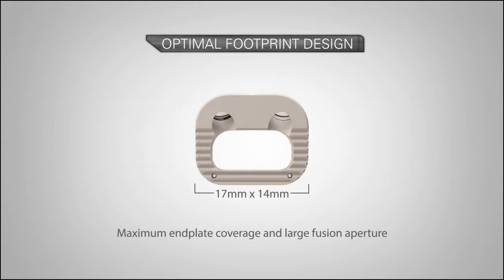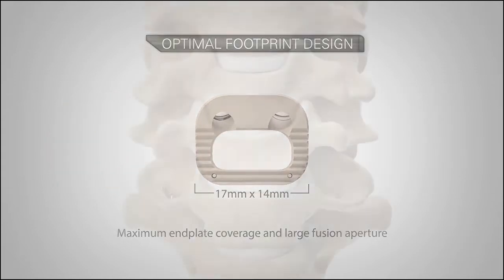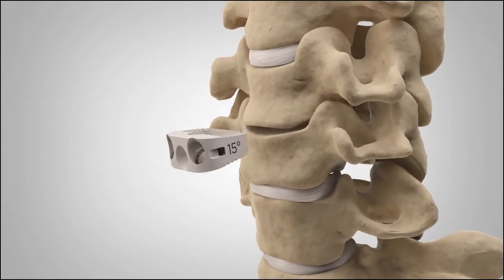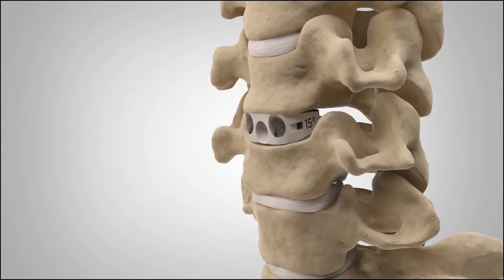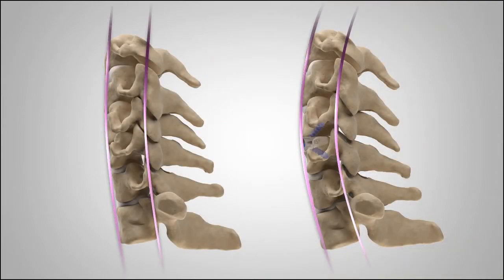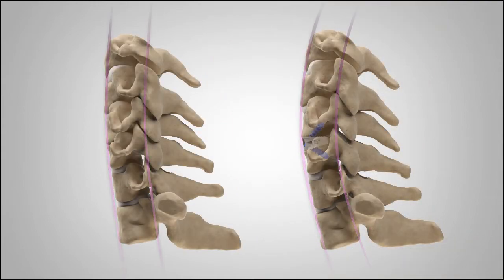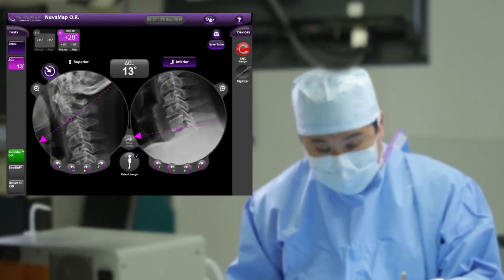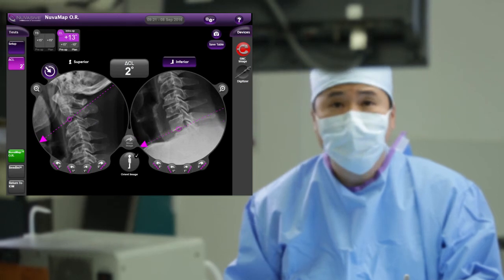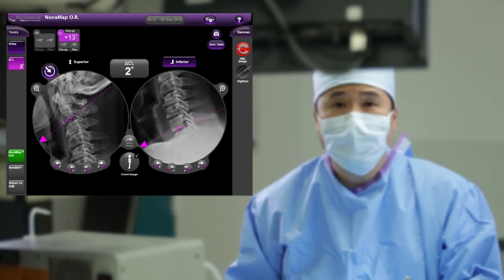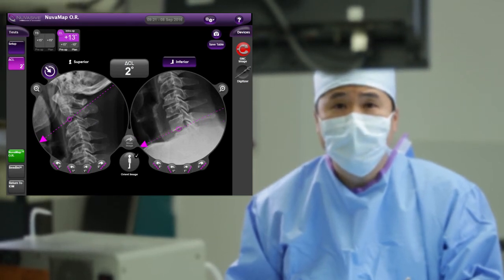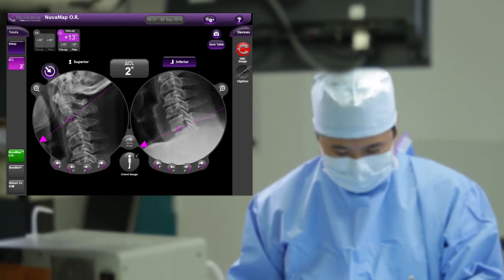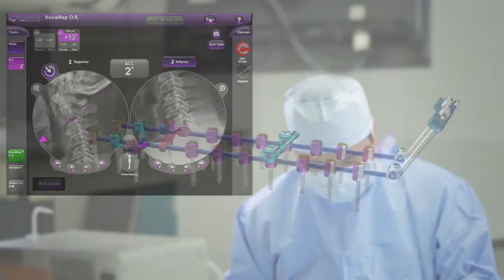The cervical ACR implants provide specific hyperlordotic implant options to better fit patient anatomy and obtain the desired amount of cervical lordosis. You will receive immediate feedback to confirm the alignment goals have been met prior to performing any posterior procedures.